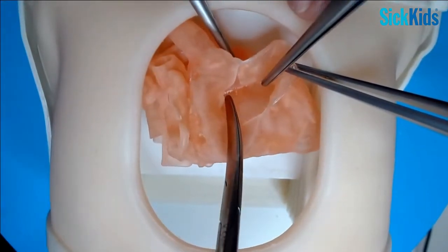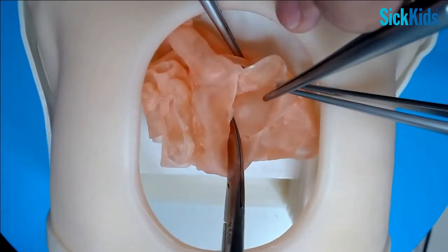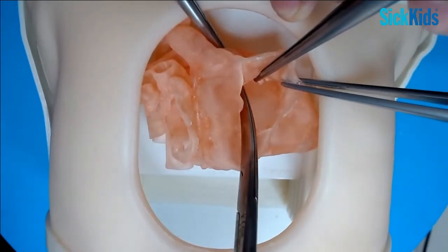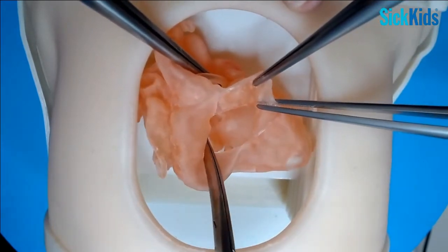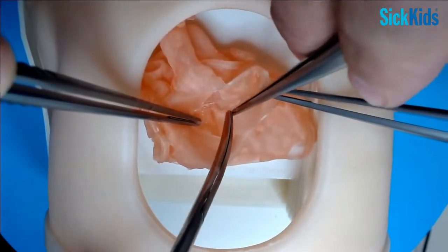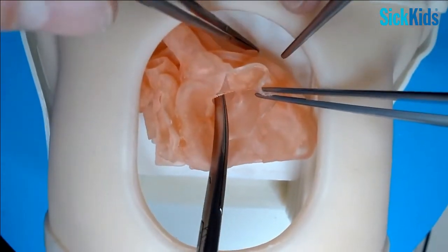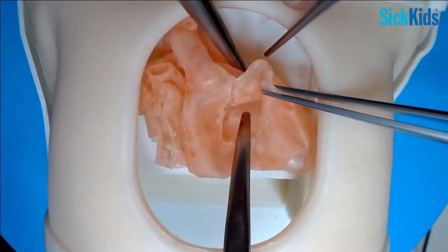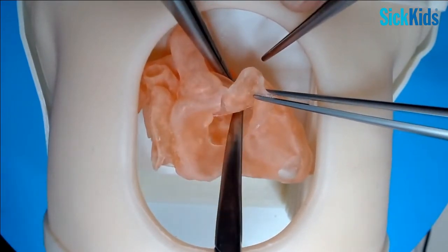I'm actually pushing in from the outside to see the imagined pathway of my VSD patch. That's the lower rim of the VSD - we're going to have to come around here, up, around the top onto that ridge, and then dropping back onto the tricuspid valve. Here's your tricuspid valve leaflet, so your conduction's going to be here because it's a perimembranous VSD. I tend to be a bit old-fashioned and do VSDs with interrupted sutures - you can see it would be a lot of sutures to do this, it's a long journey, but I'd still feel safer doing it with interrupted sutures.